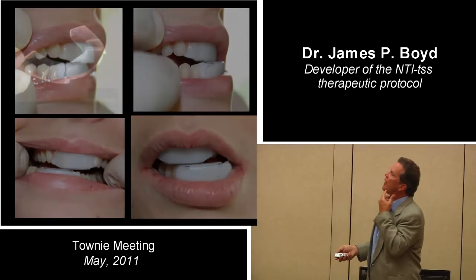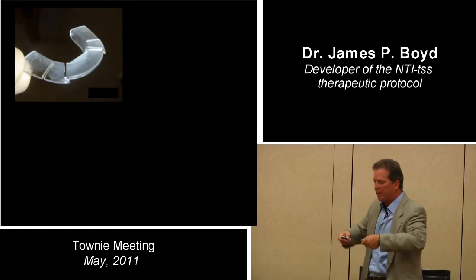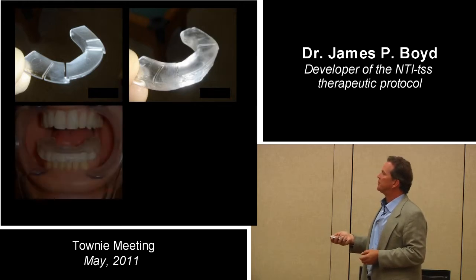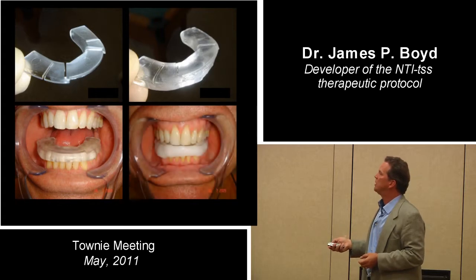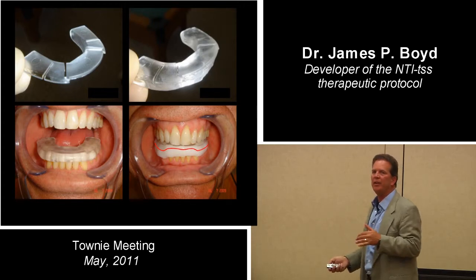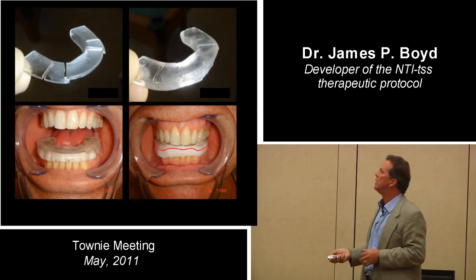Here's a lower flat plane tray now, and it's segmented so that you can expand and contract the arch. It goes wide, narrow, and you can torque it this way. This is what we're going to make after lunch. Here's too much thermoplastic in there, which I have been doing a lot lately, too much of. Here it is sitting on the lower arch, and the thermoplastic cools. I should have had way less thermoplastic on here because there's way more than I needed. There isn't any fear of this thing popping off. It's got terrific retention. That's plenty of retention.